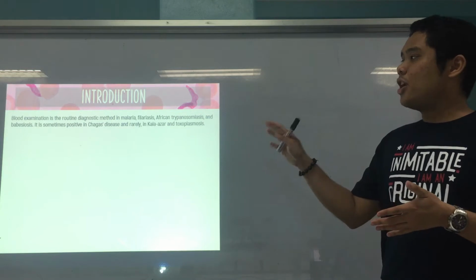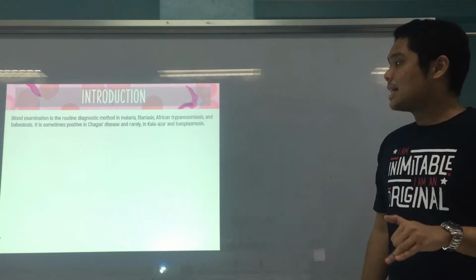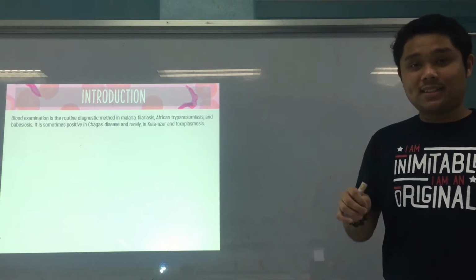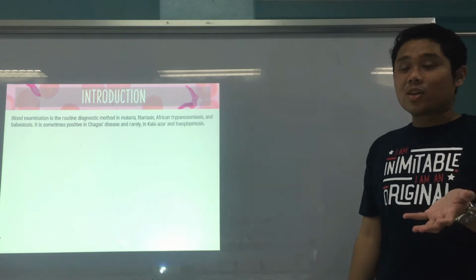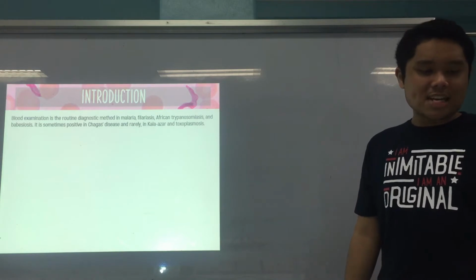Blood examination is the routine diagnostic method, of course, for malaria, filariasis, African trypanosomiasis, and babesiosis. It can also be used in Chagas disease and rarely in Kala-Azar and toxoplasmosis. We'll focus on those parasites later.